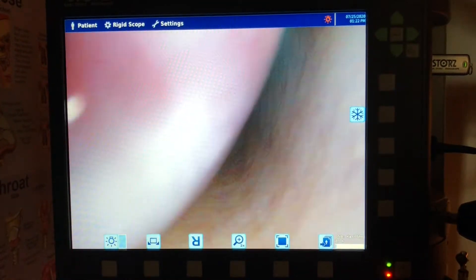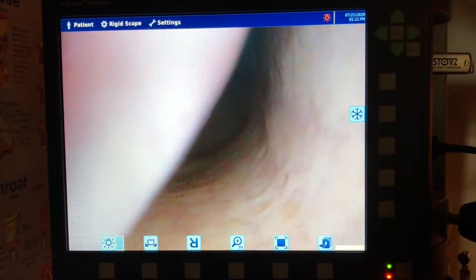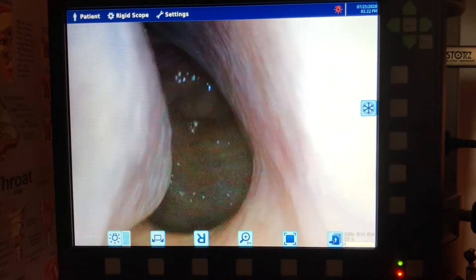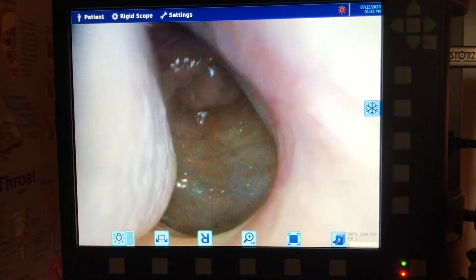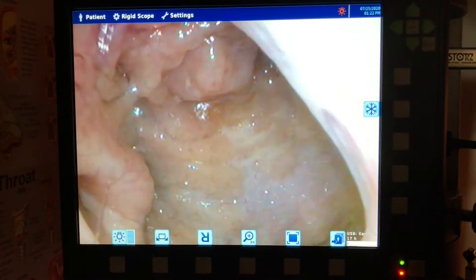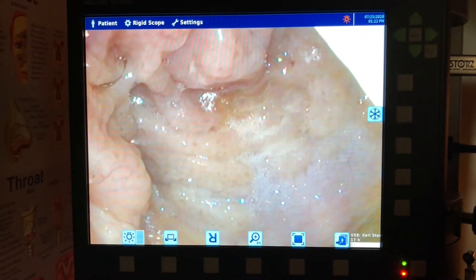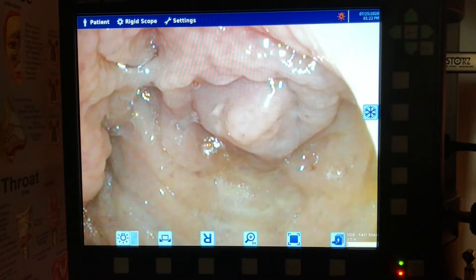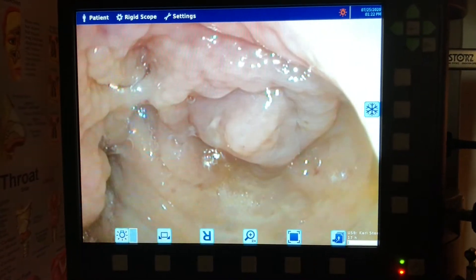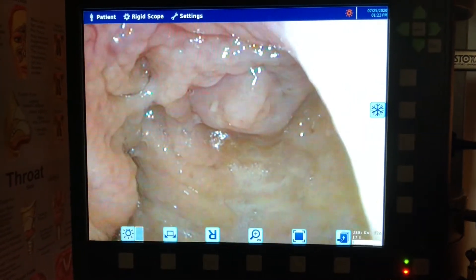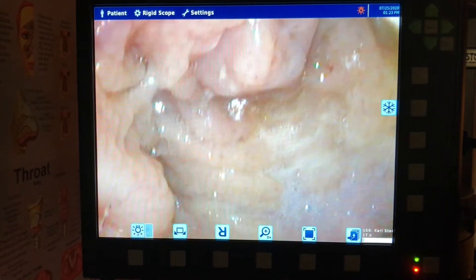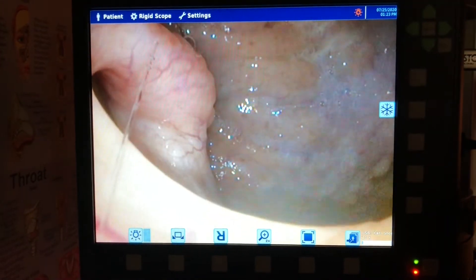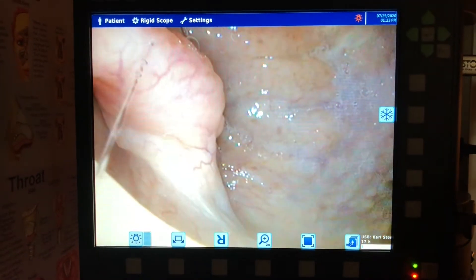We go along beside the inferior turbinate, and this right here — the back — is called the nasopharynx. That's actually a little bit of adenoid tissue that we're looking at right there, and over here is the opening to the eustachian tube.